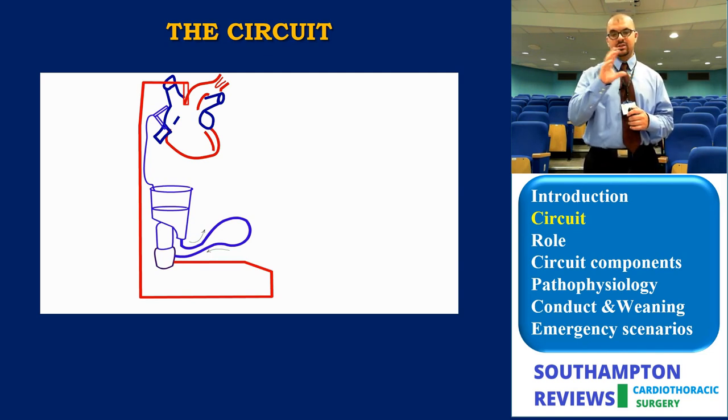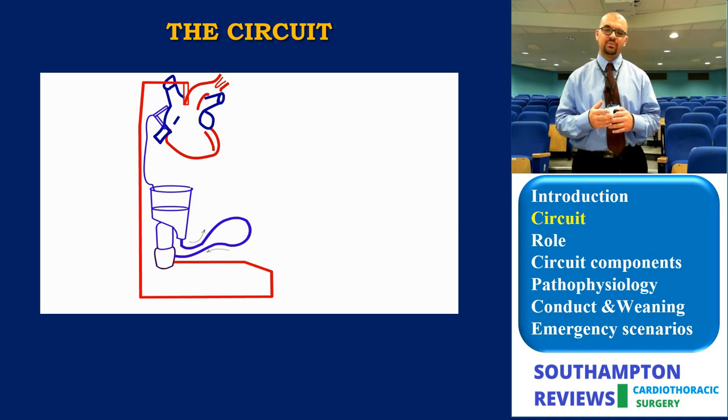The blood needs to go to the oxygenator. Although the oxygenator in almost all commercial brands is attached or in the same frame as the reservoir, however, if you check clearly, it's separate, it's disconnected. They are not in continuity. The blood needs a driving force. From this point on, it's all about pumps and driving forces. Gravity is only used to lead blood out of the heart. However, from this point on, there must be a pump driving the blood.